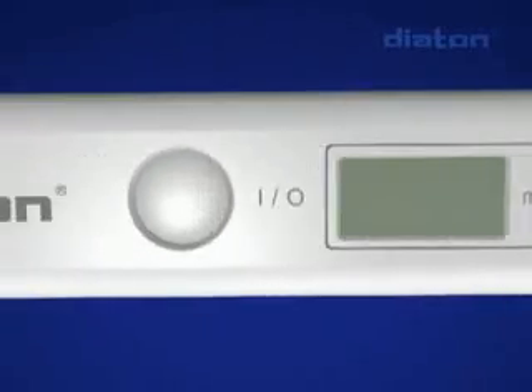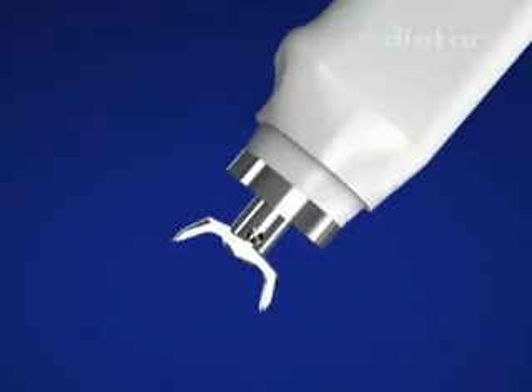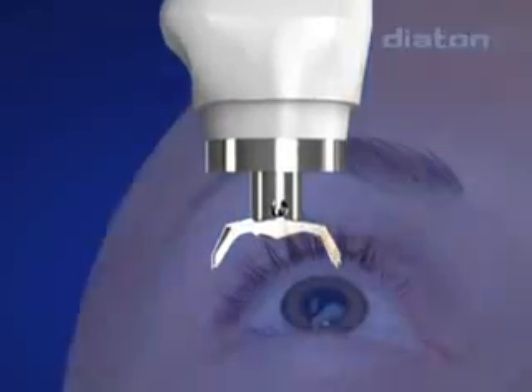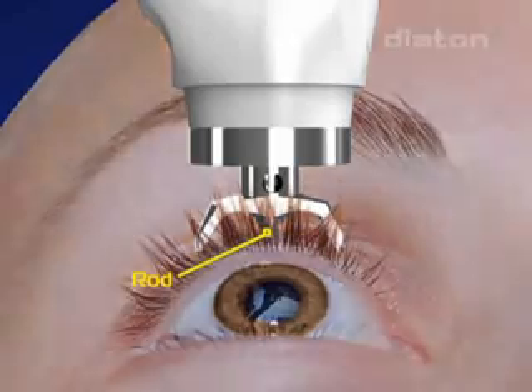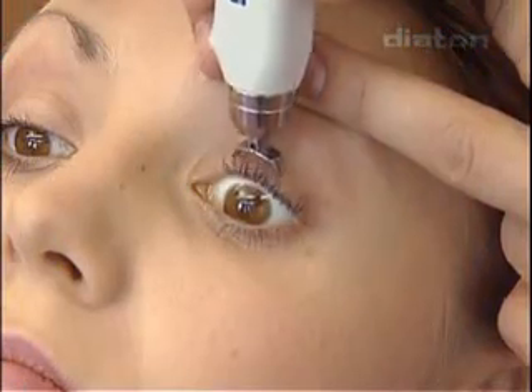The tip is intended to fix the tonometer at the eyeball on the upper eyelid during intraocular pressure measurement and to eliminate the damping properties of the eyelid. There is a free-moving rod inside the tonometer which interacts with the elastic surface of the eyeball through the eyelid in the area of the sclera corresponding to the corona ciliaris.